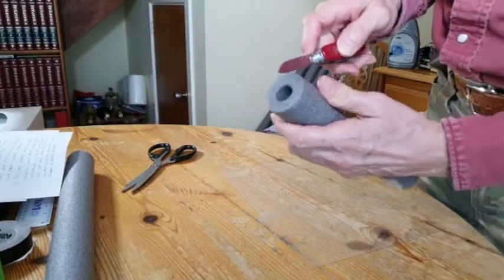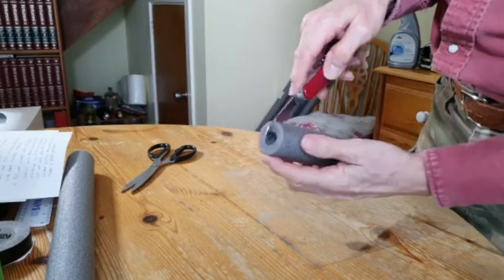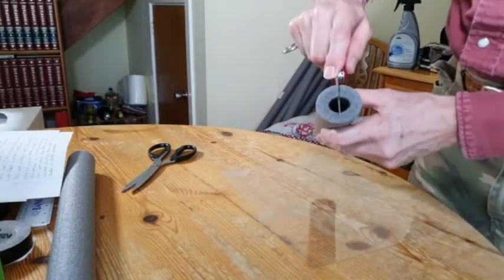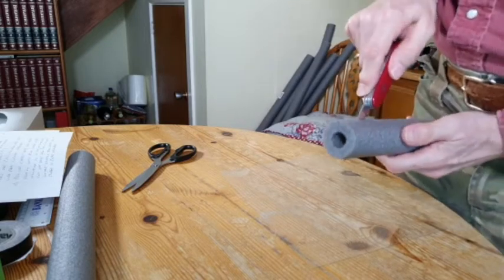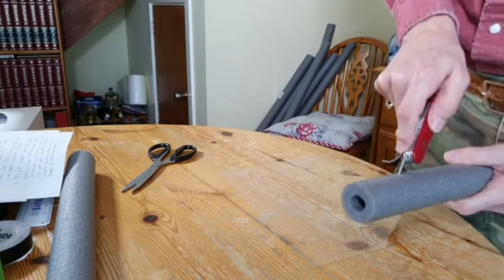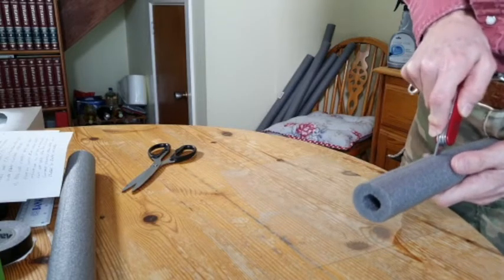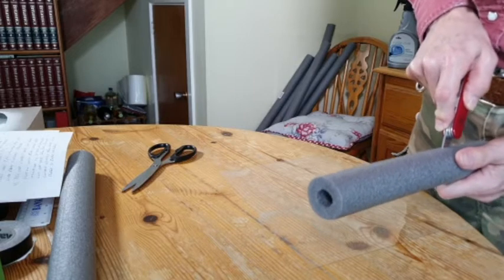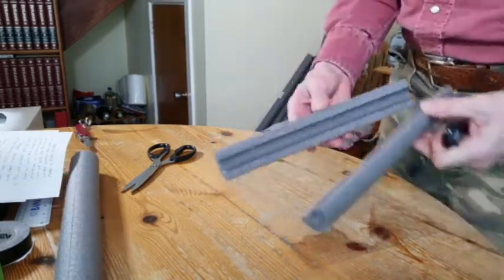Next, take the knife carefully, find the cut line where it would already be pre-cut, ready to put on a pipe. Slice it through, but when you slice it through, go right through and make sure it's nice and square so that both sides are the same. There we go, all the way along, very carefully. Do it slowly and watch you don't cut yourself. You now have two halves.